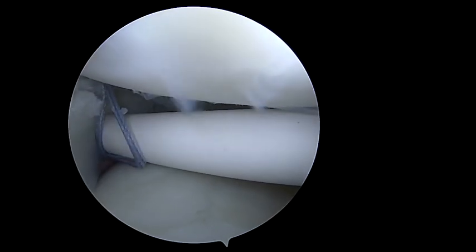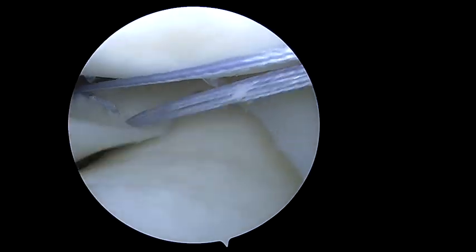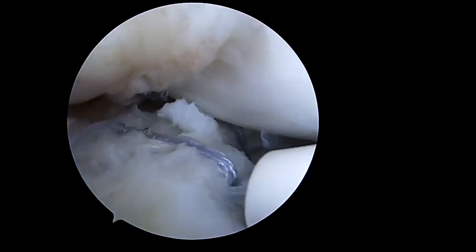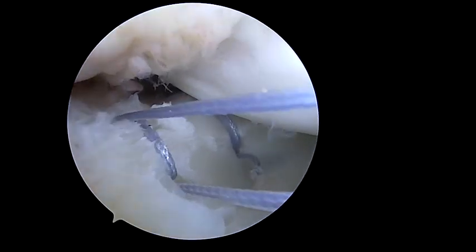You can see here that the first of the fiber stitch sutures is passed and achieves compression across the tear. A second fiber stitch suture was passed, again using the same technique, to complete the repair of the tear.